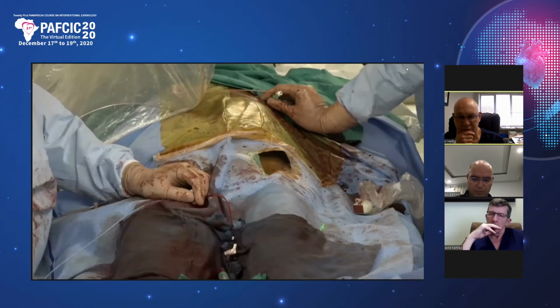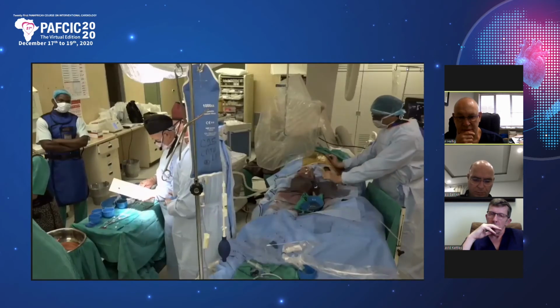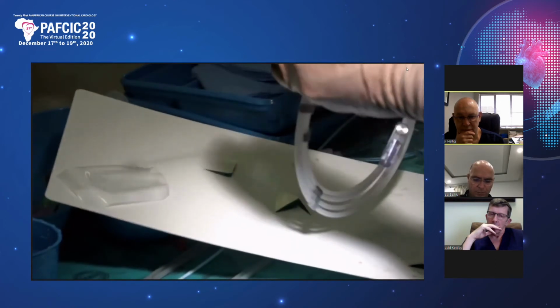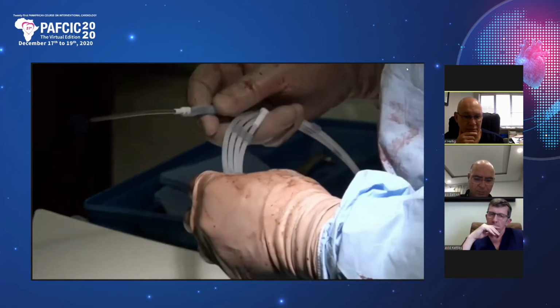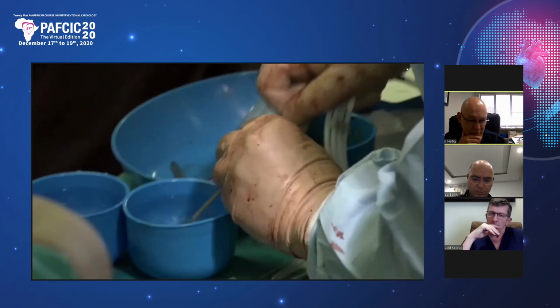We're going to have to go with the AVP3. The discs are smaller, so it may be advantageous in this case because of the difficulty with the proximity to the valve edge. No, we don't need it.